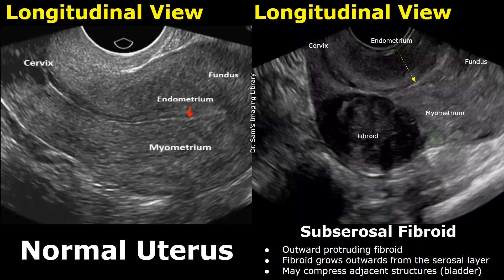This is another case of subserosal fibroid. It is usually considered a subserosal fibroid when more than half of the fibroid is protruding outwards.